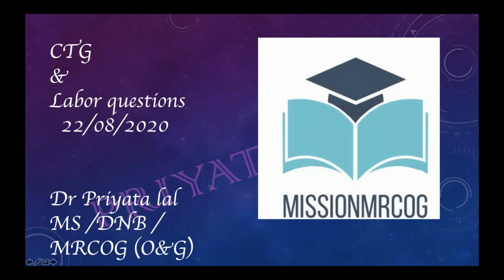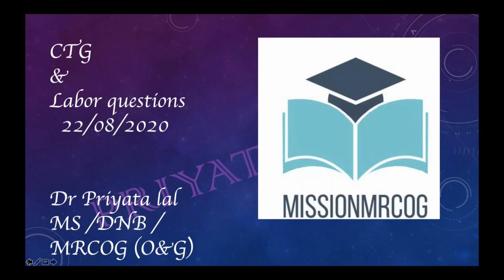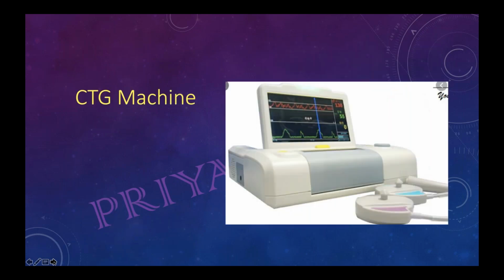Okay, so welcome you all again. So what we'll be doing in today's class: I'll be explaining CTG starting from the very basics. Then there will be CTG traces, so that you people can do that yourselves. Then there will be part 2 questions. So it is going to take a longer time. Fine. So now let's start.